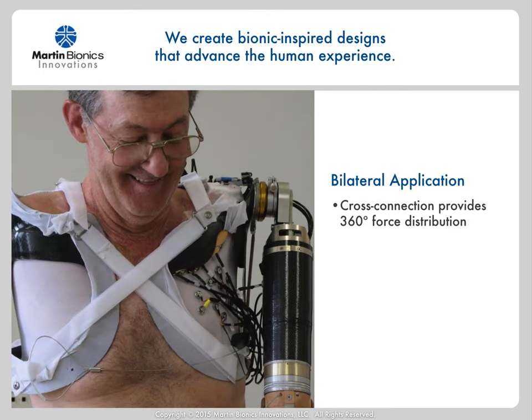We also applied the socket design to bilateral cases and found great success. We simply cross-connect the top of one side to the bottom of the other, so that the force of the prosthetic arm hanging off one side broadly distributes the load across the opposing side torso. In this particular case, this gentleman had undergone a targeted nerve reinnervation procedure, allowing him to have simultaneous multi-joint control using a large number of electrodes integrated into his left side socket. Since the fabric is bridged between the stabilizing unit frame like a hammock, the electrodes remain in perfect contact with his body and there are no gapping issues.